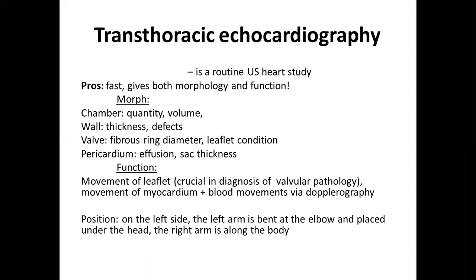So the next one is function. We can understand the movement, and primarily we will speak about the movement of the leaflets of the heart by using M mode, like motion mode. We can understand how the myocardium and septum are moving, and how the blood is moving by using Dopplerography.